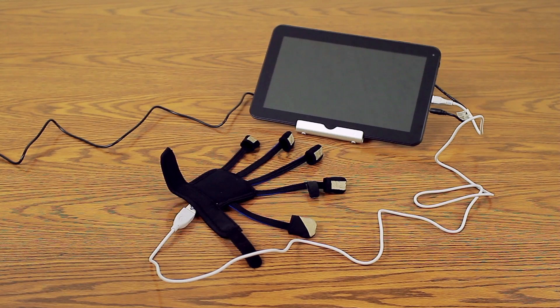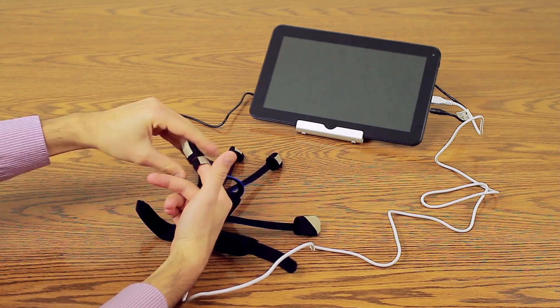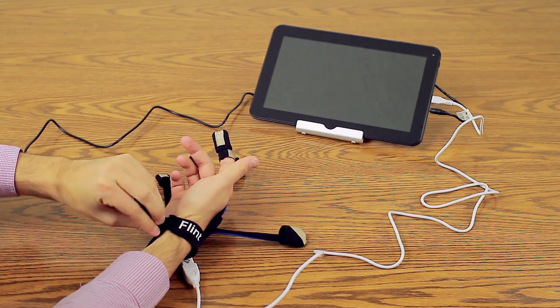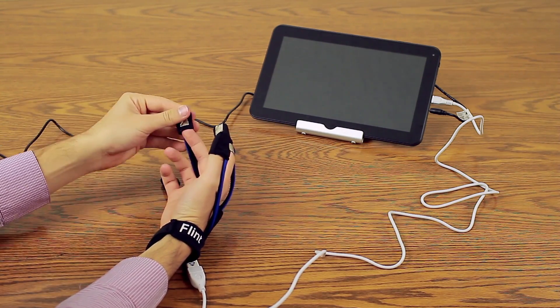Next, put on the glove. To do this, first slip the index loop over your index finger and pull down so it rests between your knuckles. Pull the index cot over the tip of your index finger. Secure the strap around your wrist. Then pull the thumb cot and the remaining other cots over your fingers.